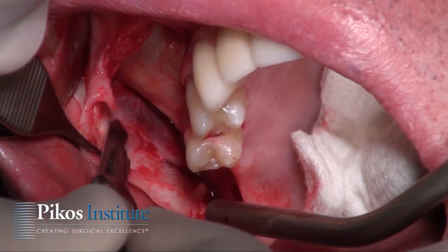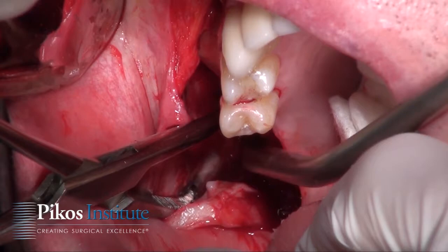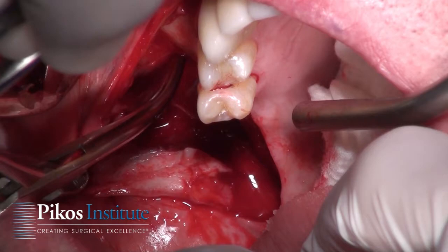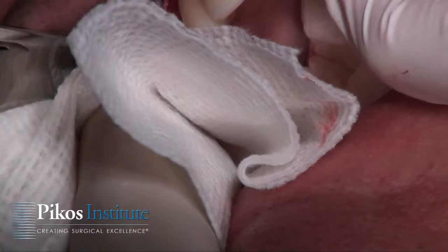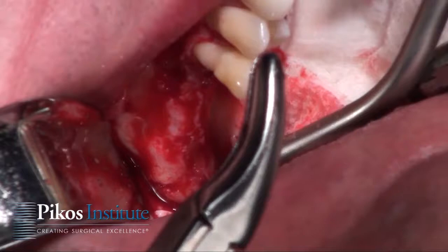If I just reposition the flap without releasing at the very end of this case — assuming I can place these implants with healing abutments in place — that increased surface area means it's not going to work if we try to close without passivating and elongating the flap. I suggest doing that always right up front, like now. Scoring periosteum with a sharp 15 blade, then a curved hemostat allowing good buccinator muscle fibers to be released. You can also use wet gauze to finger-dissect and separate those fibers. It's important to do it right up front because there will be some bleeding, and you don't want to deal with periosteal release at the very end when you're ready to close.